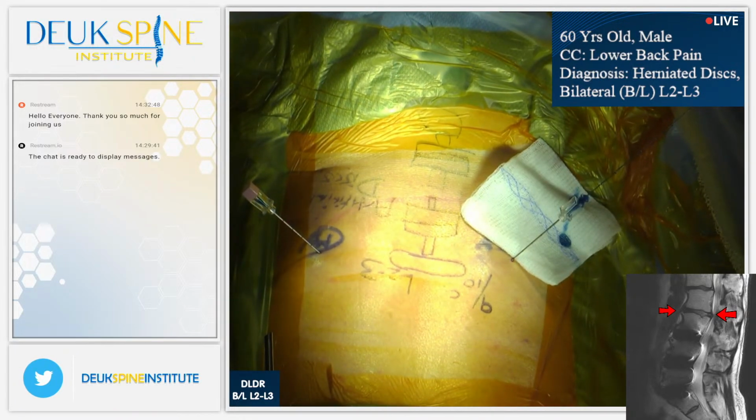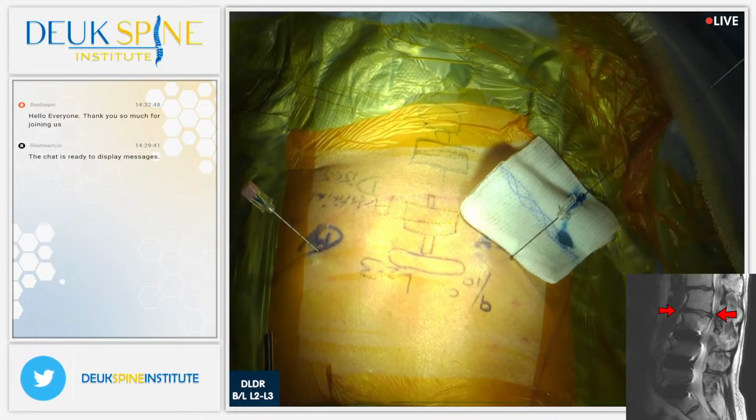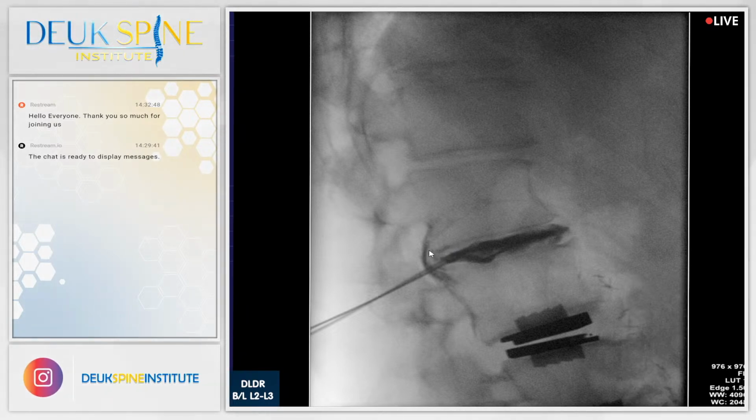Jordan, show us on that x-ray. Henry, take a look at the x-ray. You could see a tear in the back of the disc. See the tear right there? Circle it, yes, the black tear. And that's the dye escaping through the tear. And now look at it covering the herniation. It leaks out and gets on top of the herniation so you could see it. And he's got a herniation on both sides. We're going to go in there and clean that up.